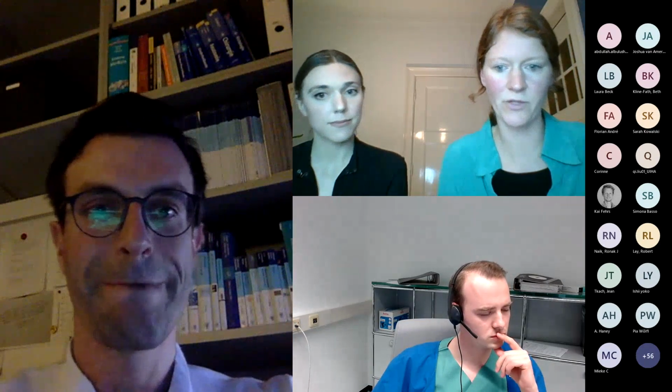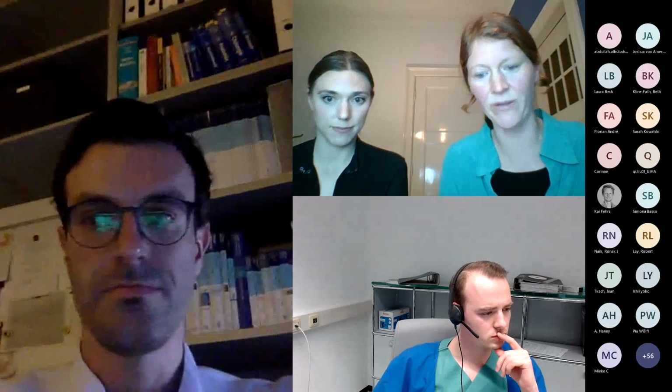But yeah, I think in most cases we leave it next to the scanner in the scanning room, and it's no problem. Yes, that's completely fine. You do not need to take the headphones out of the room, but they should definitely not be in the bore on the table. They should be off the table and out of the bore, but they can be in the room. Yes.